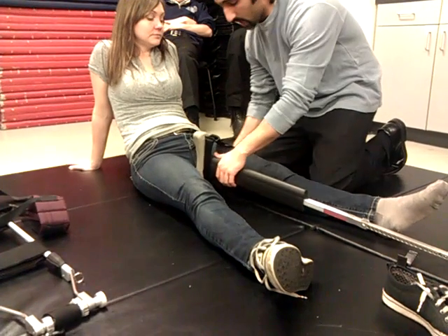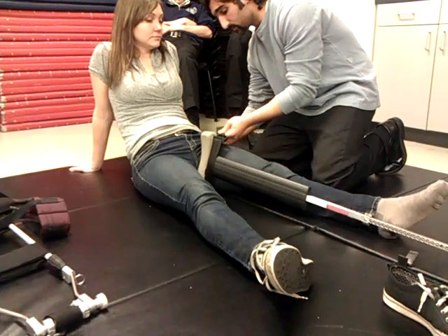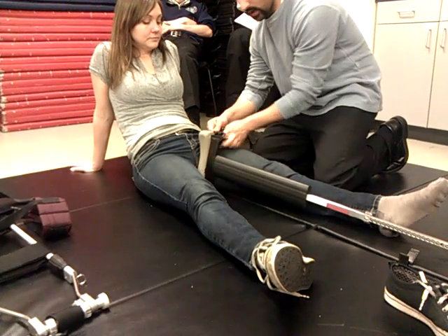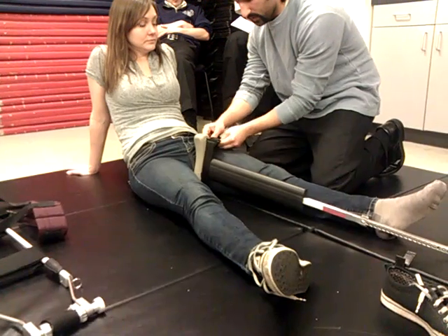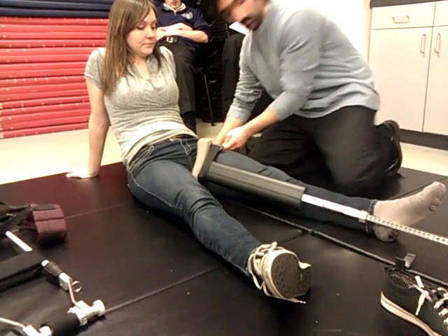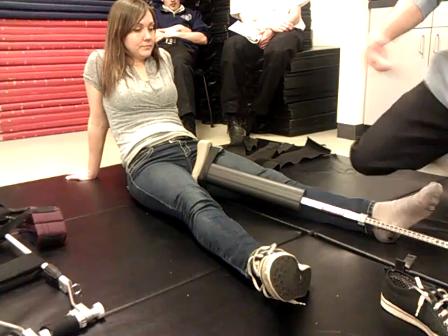So you're going to slide the strap up as high as you can. Once it's as high as you think you can get it, you're going to start securing it down with the push-pull maneuver. From there, you're going to go ahead and secure the ankle strap.